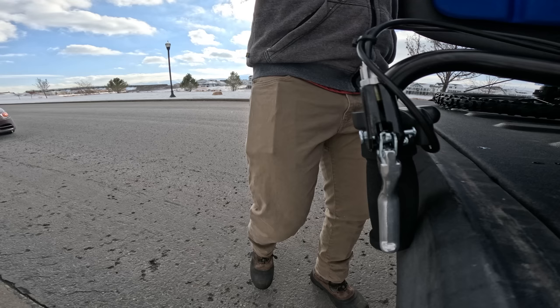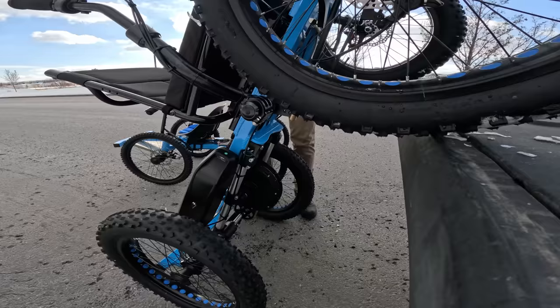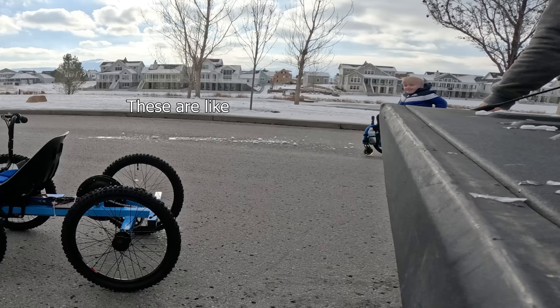Today, Cole thinks he's coming for a test drive, but we're going to give him a kid rig of his very own to keep. But he doesn't know that yet. These are like motorcycles, but like dune buggies.